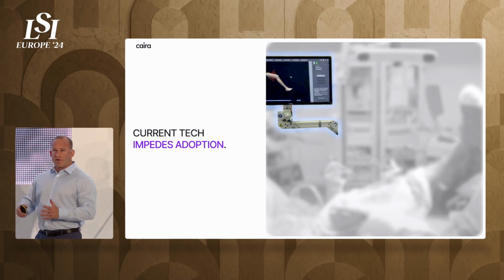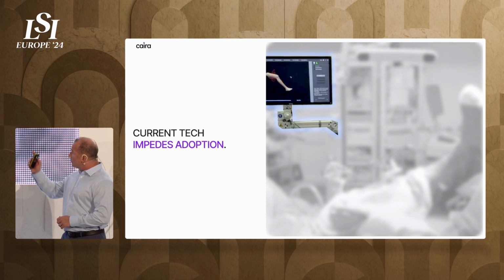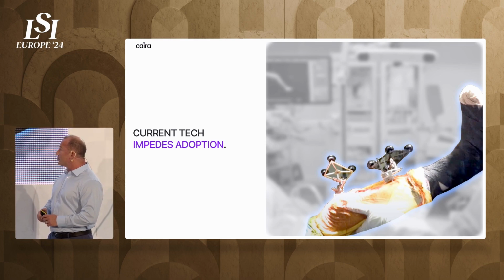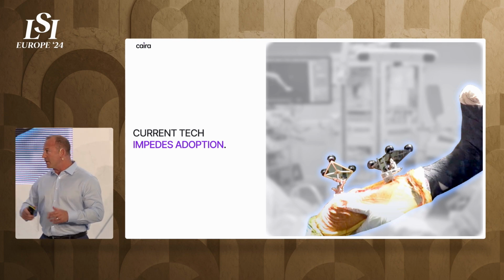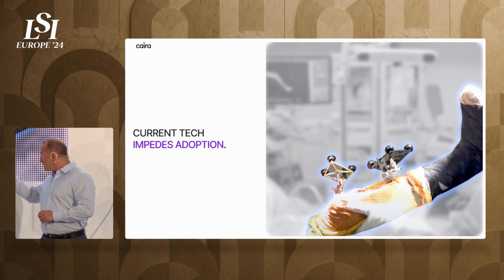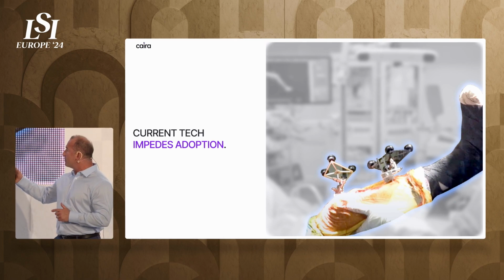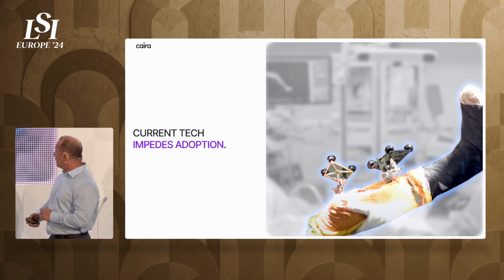So I'm going to walk through very briefly a couple of images of a navigated knee replacement surgery. You have a user interface, oftentimes out of the sterile field, that has to be operated by oftentimes a company representative. You have fiducial trackers. For joint replacement, optical tracking is the state of the art, and optical tracking requires the use of these large fiducial arrays. This is a knee, so tibia, femur. Each one of these arrays is held in place with 2 bicortical pins, meaning they go all the way through the cortices. That requires additional incisions. In this image, it's an extended incision, but more often than not, it's 2 additional incisions in the tibia, 2 additional in the femur, and then the violation of the bone.